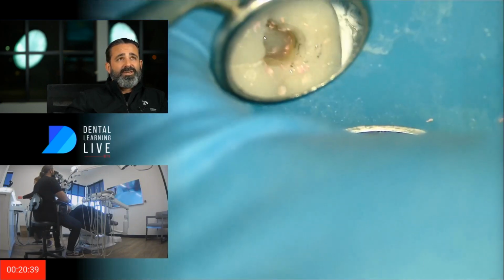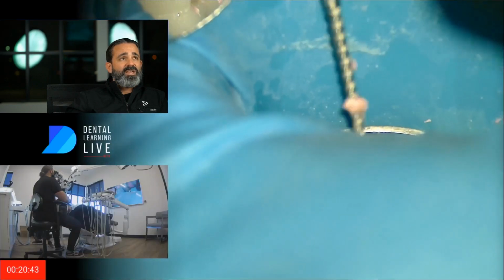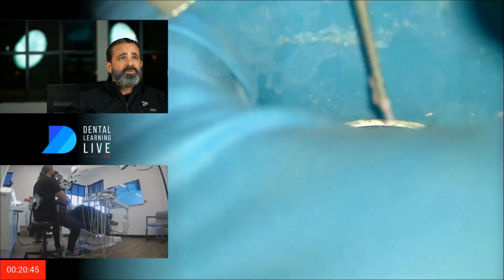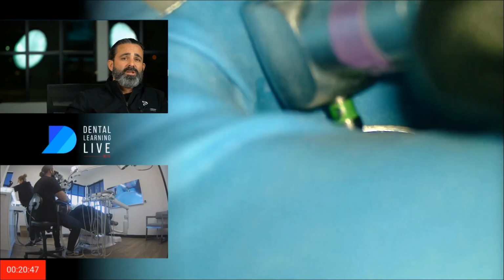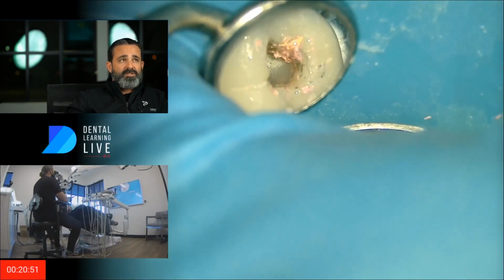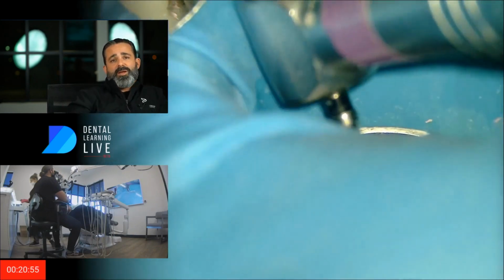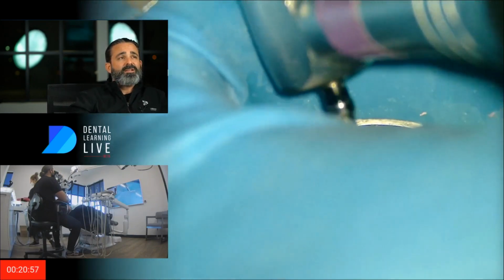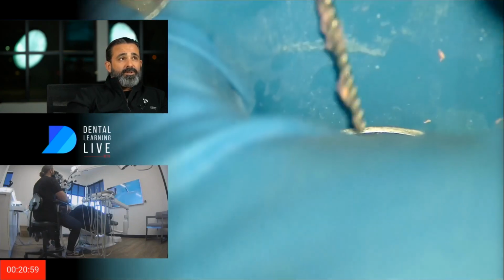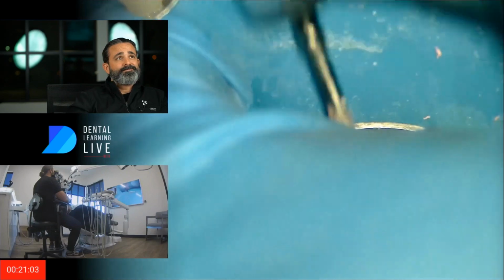I actually grabbed an old Lentulo file. I find that a lot of times those Lentulo files will actually engage that, especially when they're soupy, and that's what I used. You could also just continue to wick it, just keep the solvent in there. You could see what came up now here. You could also use the solvent in a paper point to wick it. It's another technique. But this time, I just wanted to use files, apparently.